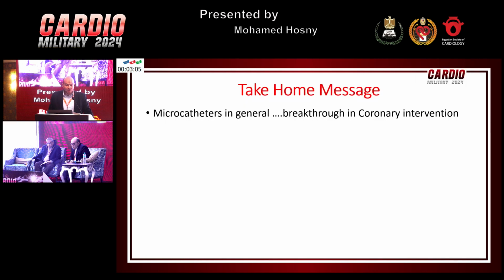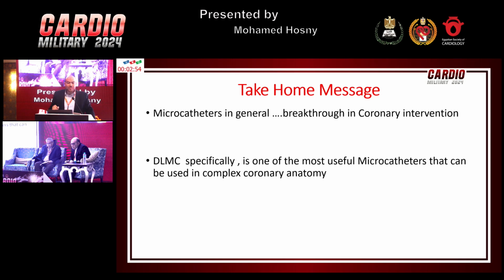So my take-home message is that microcatheter in general, in my opinion, is the most important breakthrough in coronary interventions, specifically the dual lumen microcatheter, one of the most useful microcatheters that can be used in complex coronary interventions, and it should be available in every cath lab for these difficult situations.